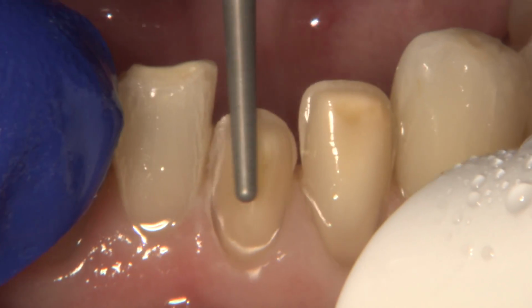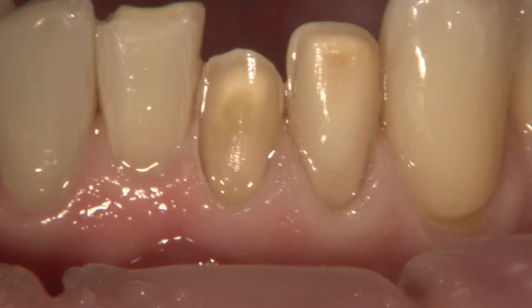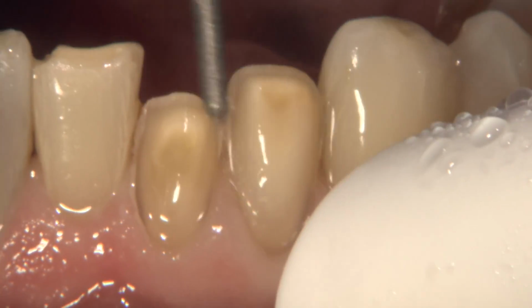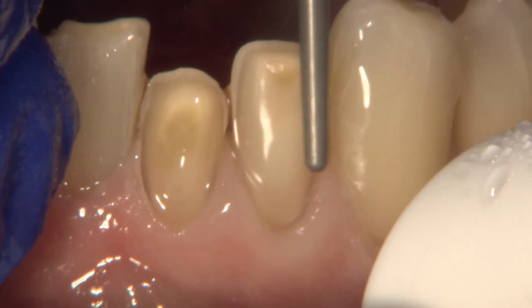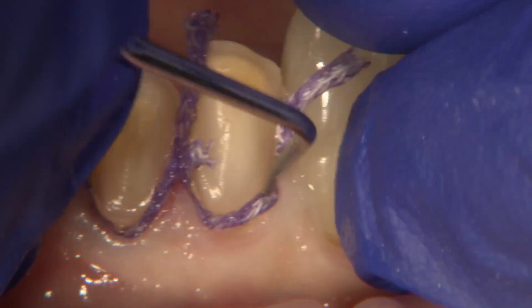I'll complete the preparations by smoothing out any rough areas with a fine diamond burr on a slower setting, and since I'm using an electric handpiece, I can set it to about 2,000 to 5,000 RPMs, and that just helps refine any rough areas on the preps. It's important also to ensure the line angles are rounded as well.